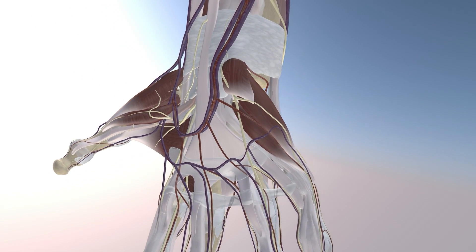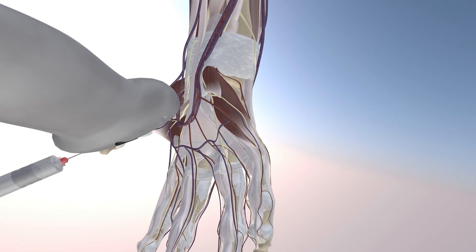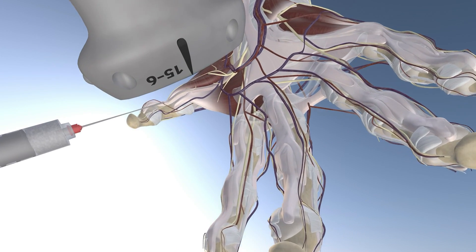Now we're rotating. Again, we're going to focus our injection over the flexor pollicis longus tendon, just around the MCP joint, and essentially over the A1 pulley.